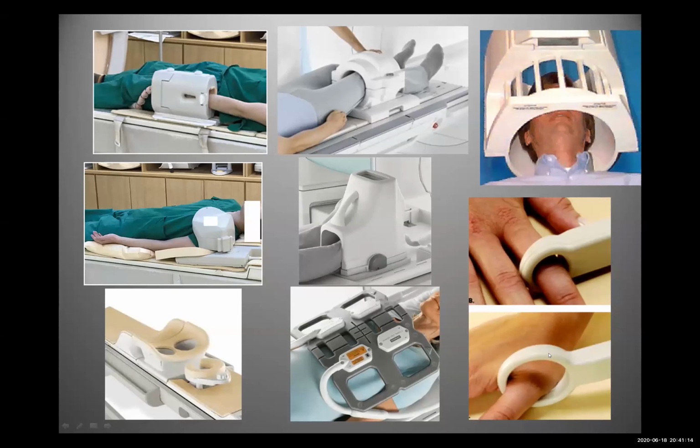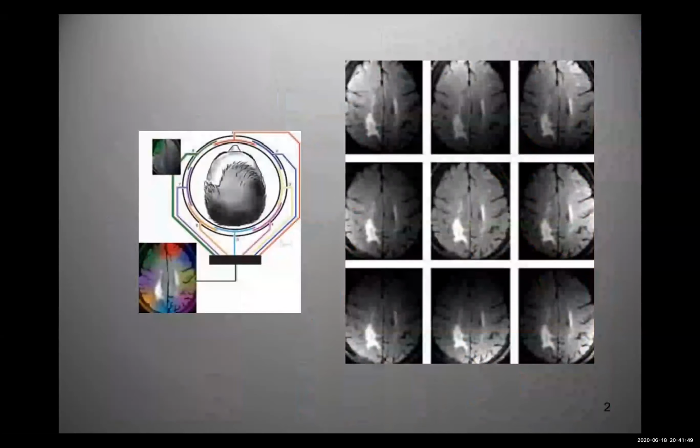On the other hand, I cannot use this for the brain because it's small. I have to have a large coil to cover the brain and to have sensitivity for every part of the brain within that coil. So just to know that, that's why we have different coils. The smaller the coil that can accommodate the anatomy that you are going to scan, the better. And there are many other things which I'm not going to talk about because this is all instrumentation engineering. But let us say the smaller the coil size, the better the signal to noise ratio.